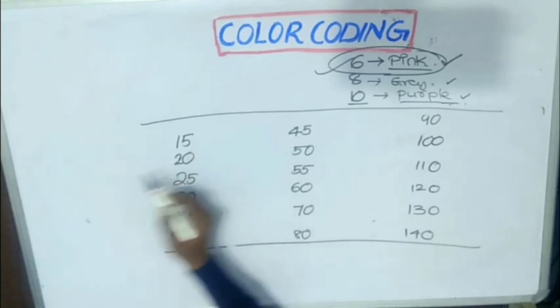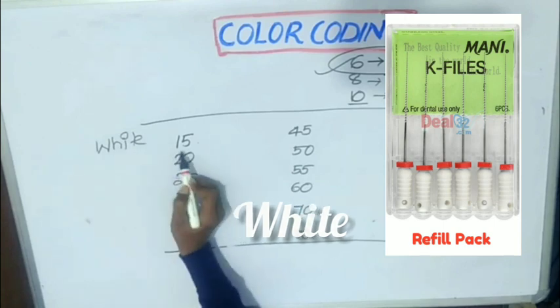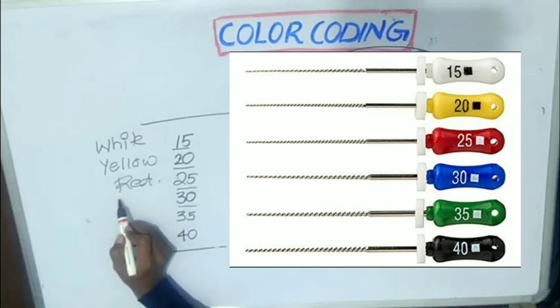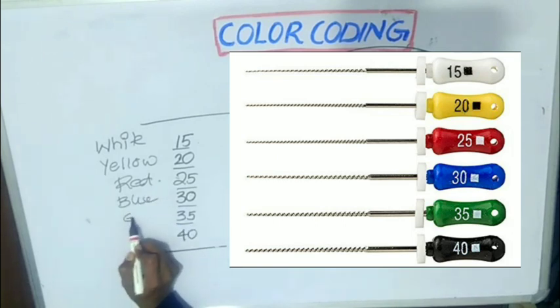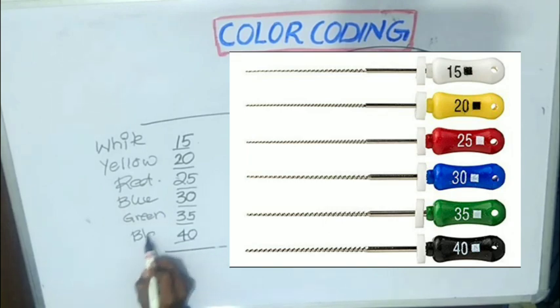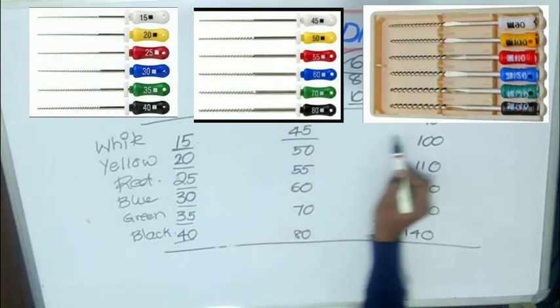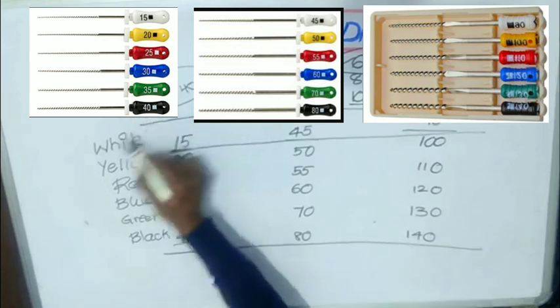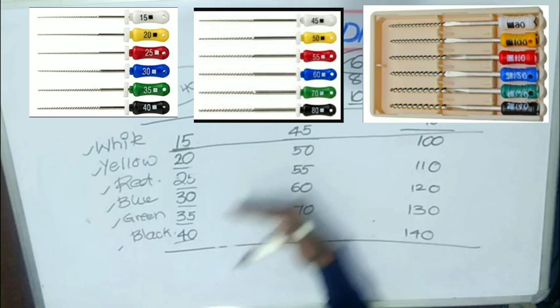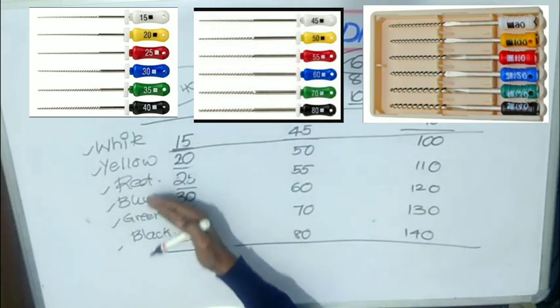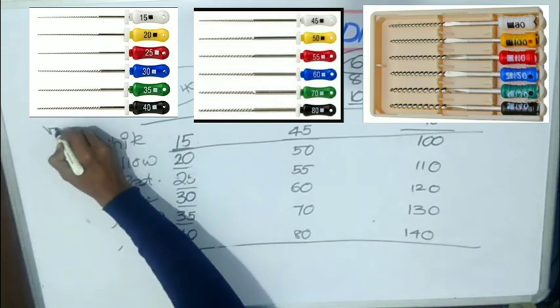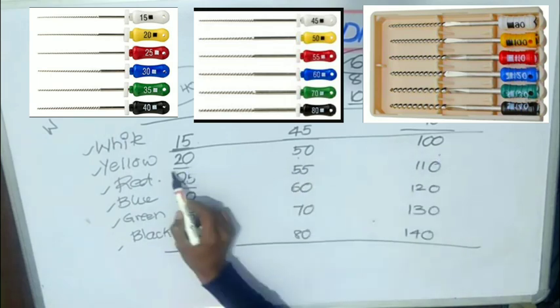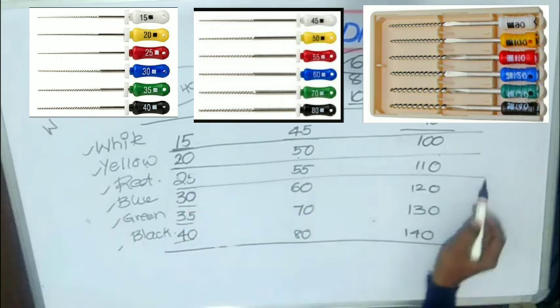If you observe the color coding of 15, 45, and 90, these are all white in color. That means, from 15 to 40, you have a color coding of white, yellow, red, blue, green, and black. From 45, again the sequence repeats from white, yellow, red, blue, green, and black. So you need to remember only from 15 to 40, that is white to black. Numbers 20, 50, and 100 have the same color of yellow, whereas 25, 55, and 110 have the same color of red.